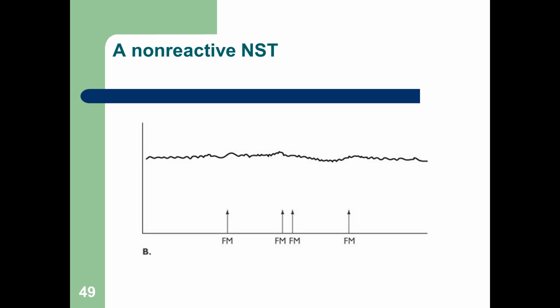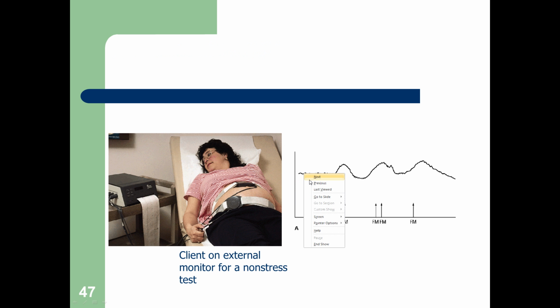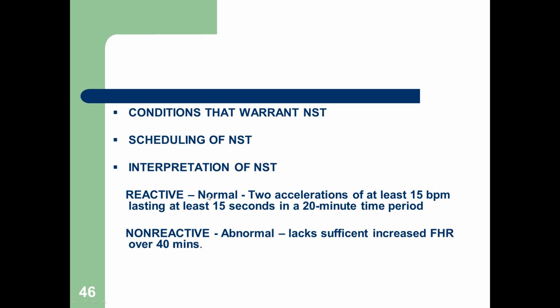Let me give you some numbers there. Let me go back. Yep, here we go. A reactive. This is very important, okay? So you got two accelerations of at least 15 beats per minute, lasting at least 15 seconds in a 20-minute period.